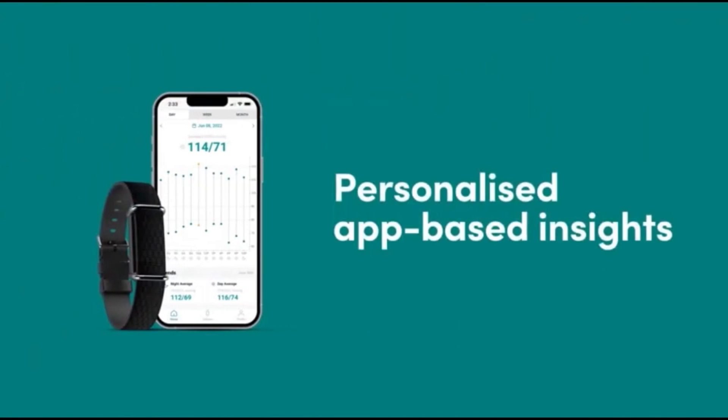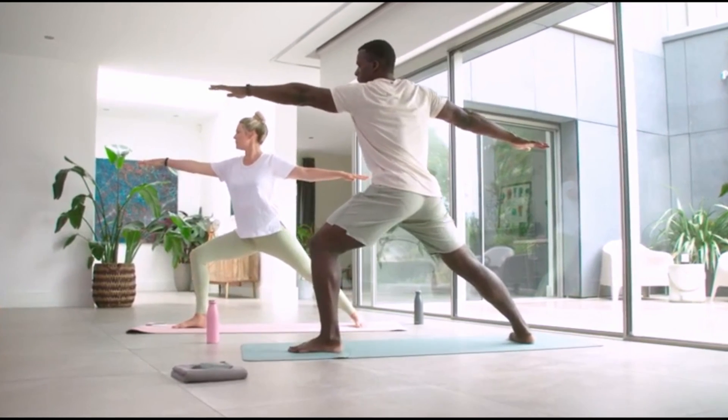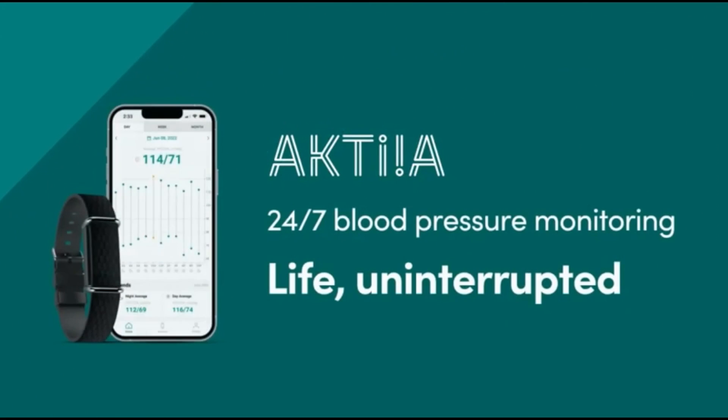That's why this device might not be used as an ambulatory blood pressure device, as an ambulatory blood pressure device requires more than just one reading every two hours — in fact it probably needs around four readings every hour, which is one every 15 minutes.